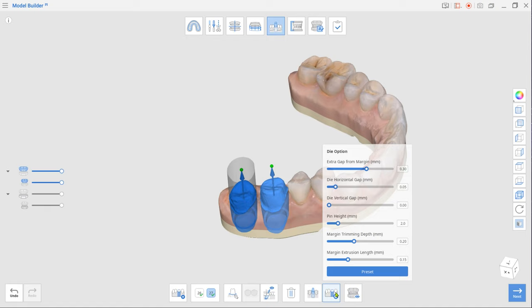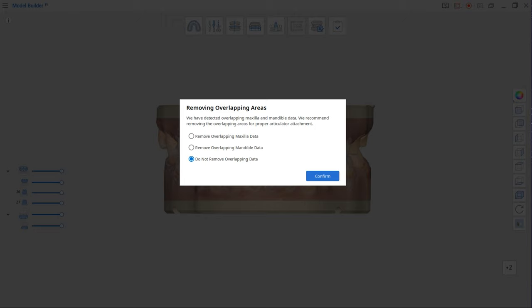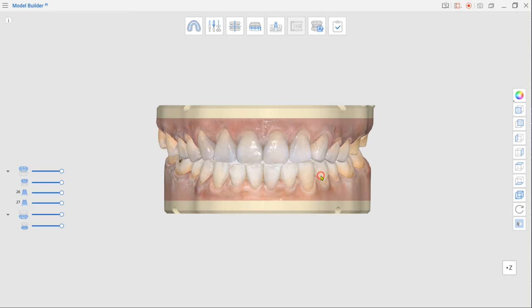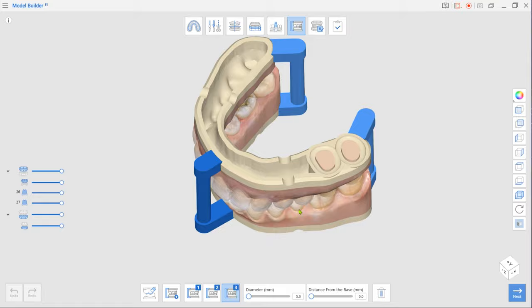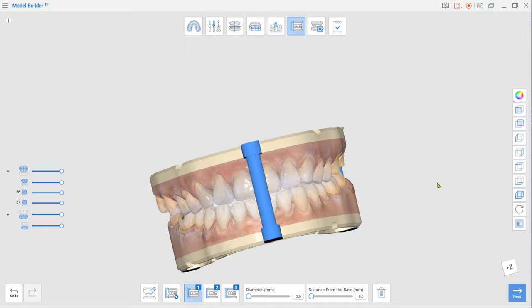Next step is Articulator Mode. The program will automatically attach 3 articulators. Use the Diameter slider to change the thickness and adjust their placement by dragging them.